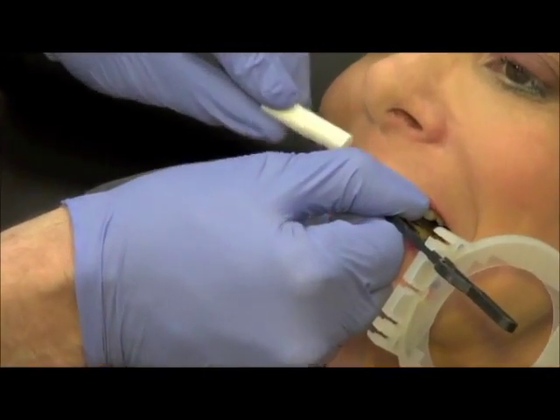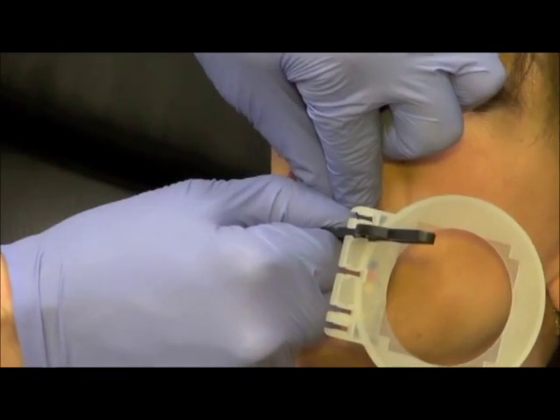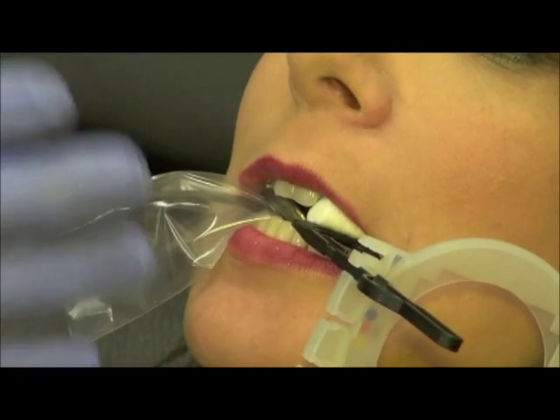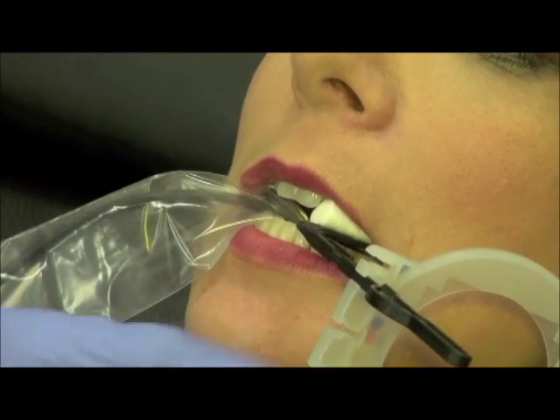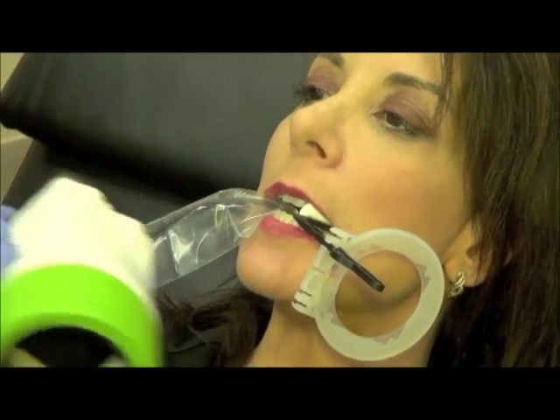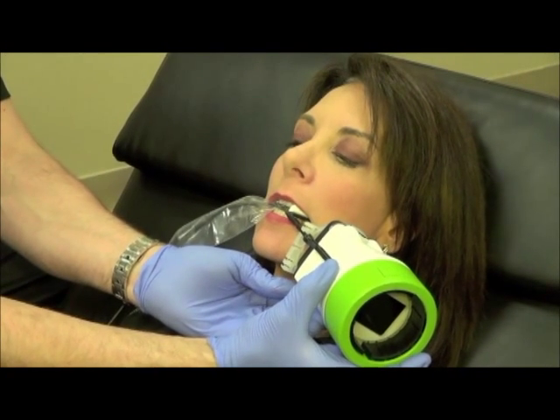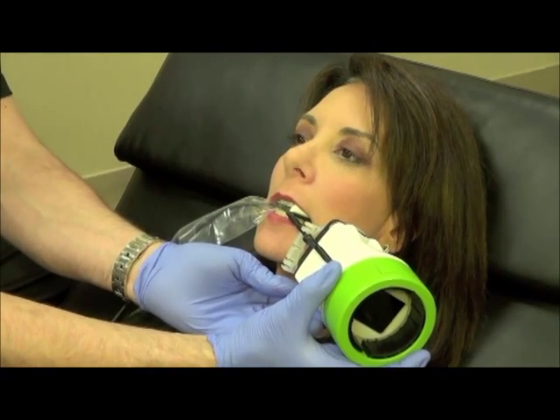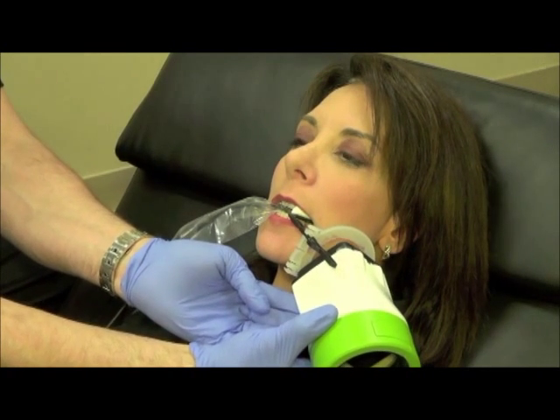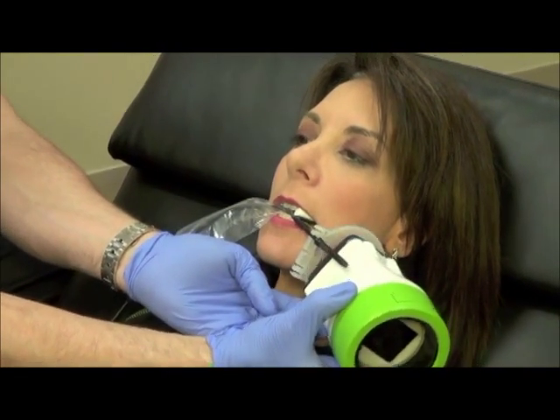If the patient has a difficult time biting, you can always put the cotton roll on the maxillary occlusal surface, which will again help stabilize and maintain the angle that we need to pick up the apices. Here you would simply have the x-ray tube parallel and flush with the alignment ring. And if you needed to get a little lower, you drop the x-ray tube down, elevate the angle, and you can pick up the apices if you missed them by having it properly aligned.